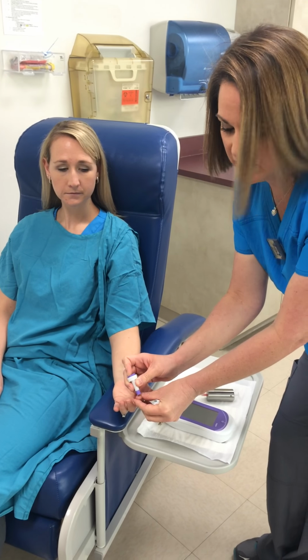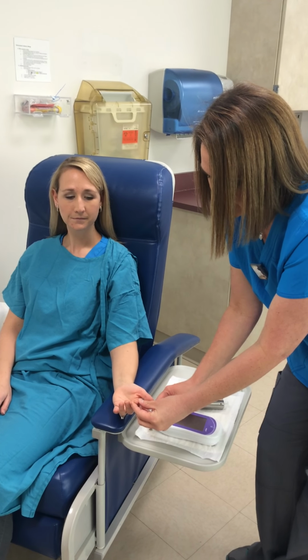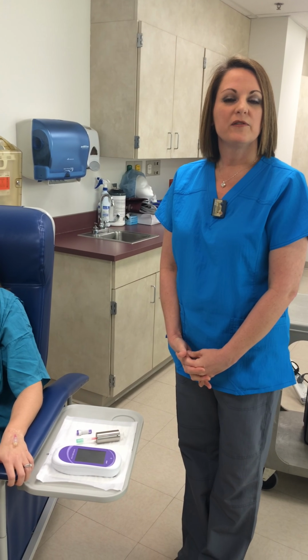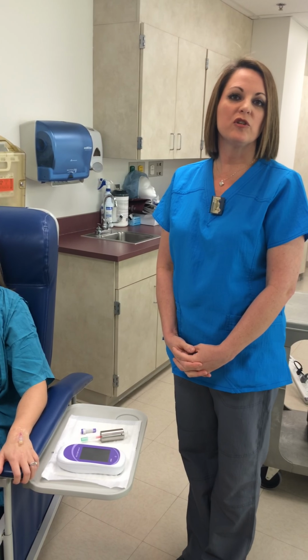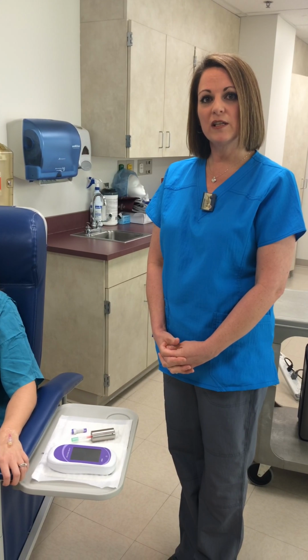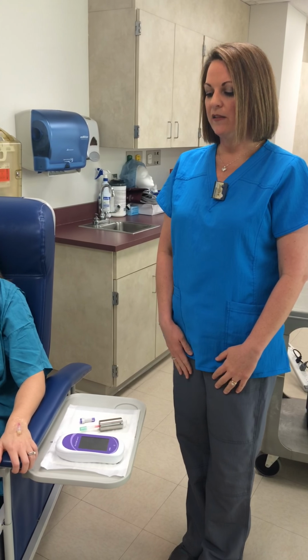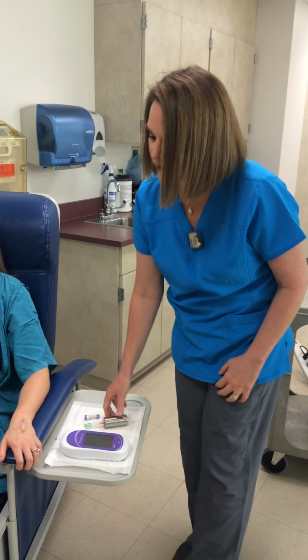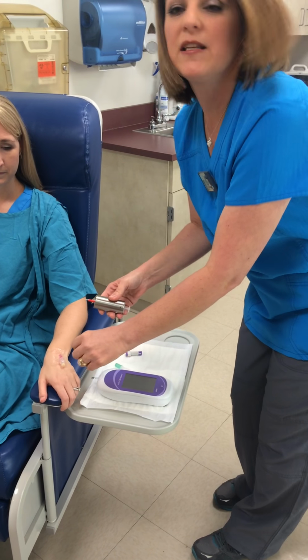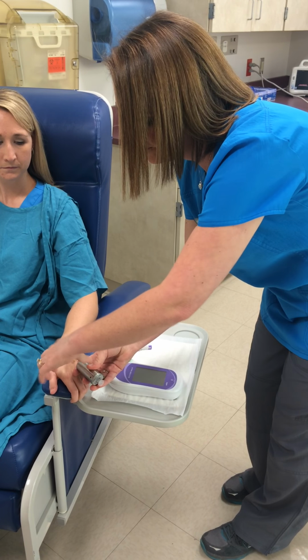That's done by doing a finger stick. We need to make sure that the blood glucose level is low enough to be able to do the test. If their blood sugar is too high, then the small amount of radioactive injection that we'll be using will be competing with what's already in their body. So once we verify the blood glucose level is low enough, I'll administer the radioactive injection. This is given through an intravenous line that goes into the bloodstream.